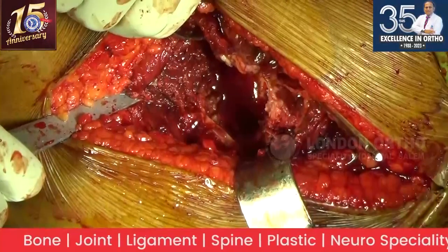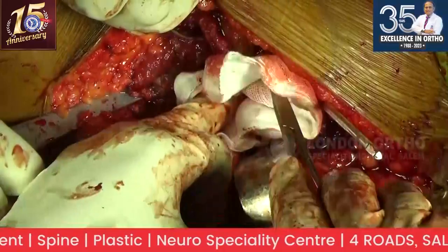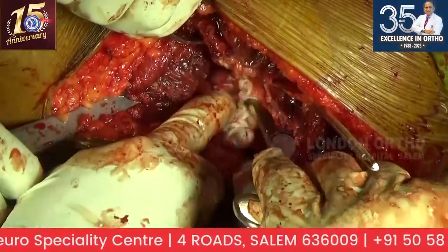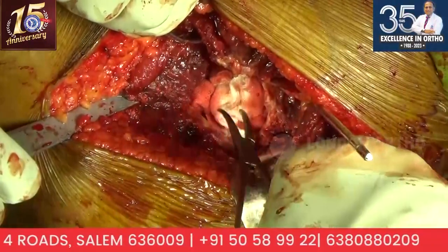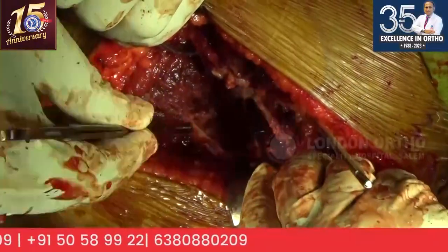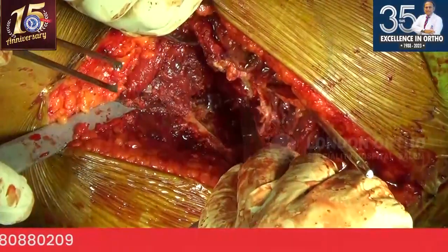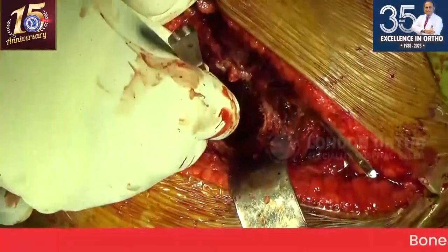Shankaralingam, are you happy with my established reaming floor? Should I ream more? Yes, sir. What do you say? He's happy. He's almost there at the floor. Maybe a millimeter or two. That's fine. It's a bit of soft tissue there. No, there was a big sclerotic ridge there, which I have removed. Okay. Now we are looking at the medial floor there. Okay.